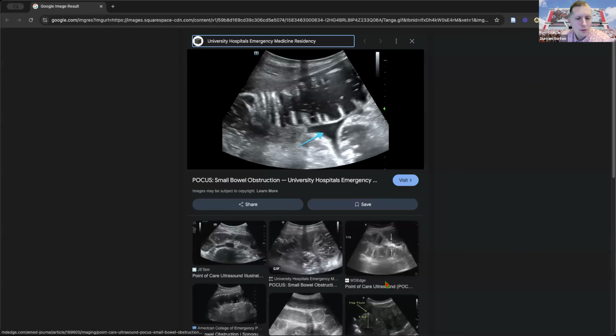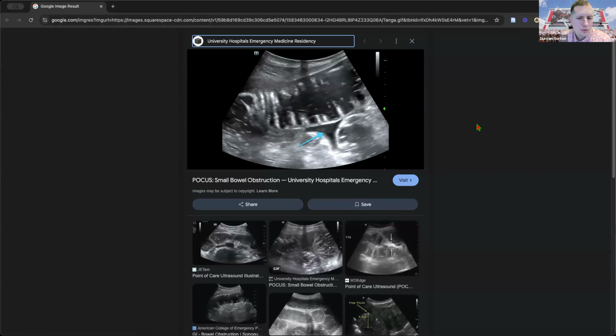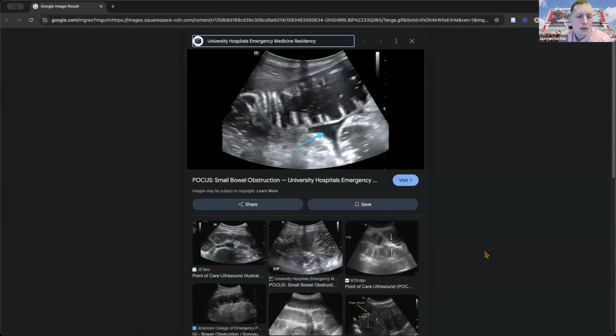That was great, Scott. Don't forget about the bladder for abdominal pain too. Because if you have an obstructed bladder, that can give a lot of abdominal pain. Oh, good image. Way to pull it. Because we've seen some kids with obstructed bladders that have presented with abdominal pain.